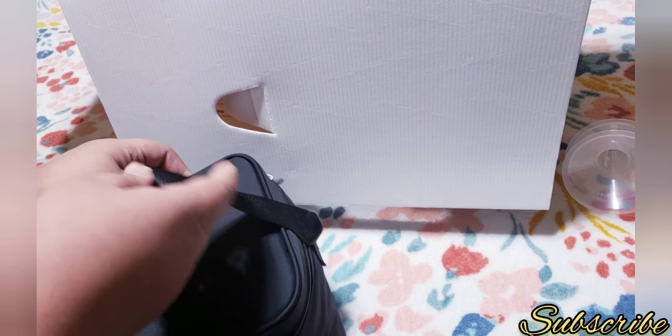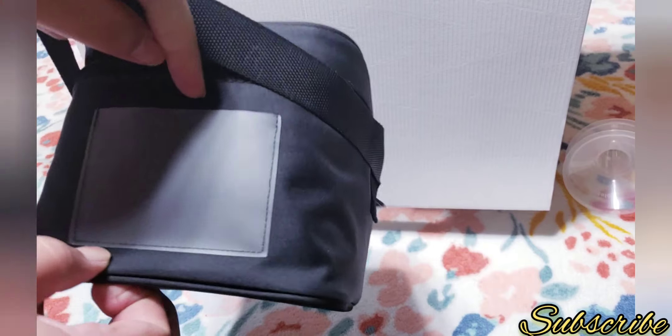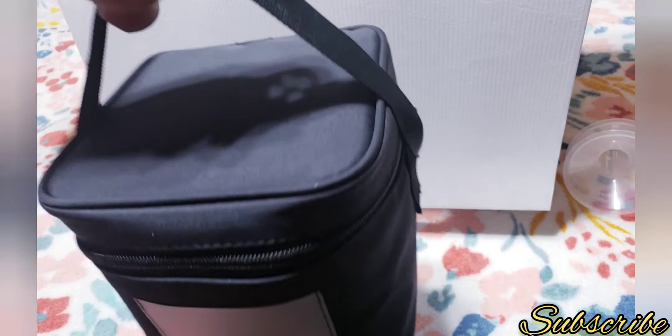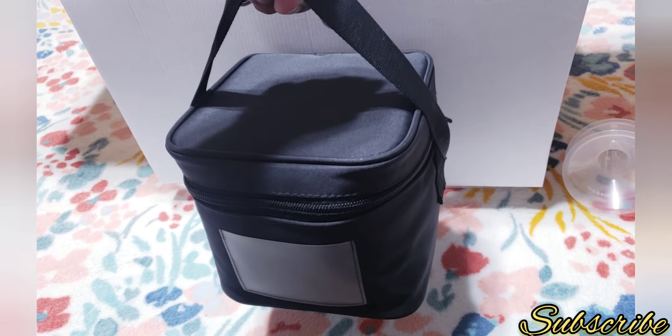It comes with this little handle so you could carry it. And in here you could put a paper with your name so everyone knows this belongs to you. It's really good quality — I really love this cooler.